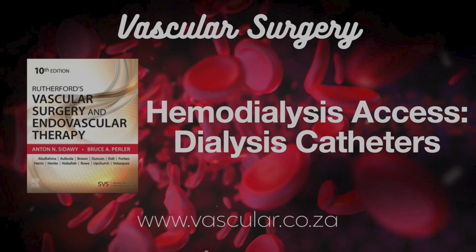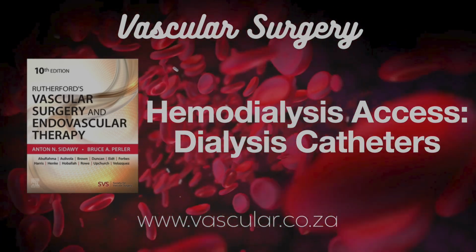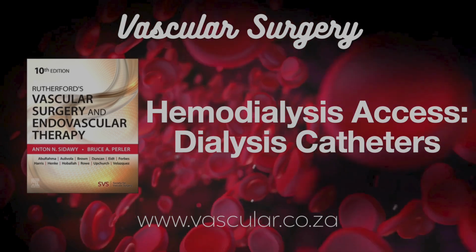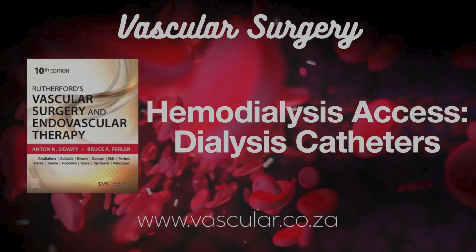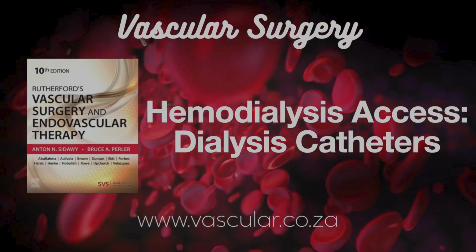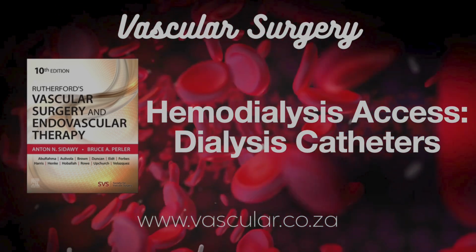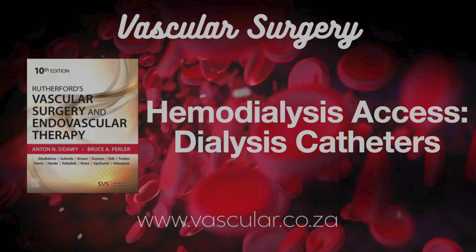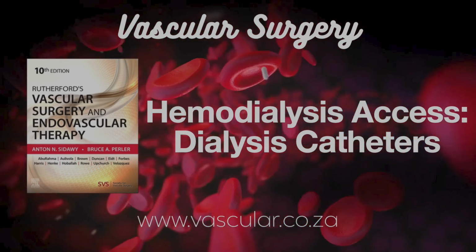Usually, local anesthetic numbs the skin, plus some conscious sedation keeps the patient comfortable but awake enough to cooperate if needed. We also give antibiotics beforehand, prophylactically, mainly targeting gram-positive bacteria to reduce infection risk. Then skin prep: meticulous cleaning, isopropyl alcohol, chlorhexidine solution, standard sterile procedure. Then comes the actual needle stick.